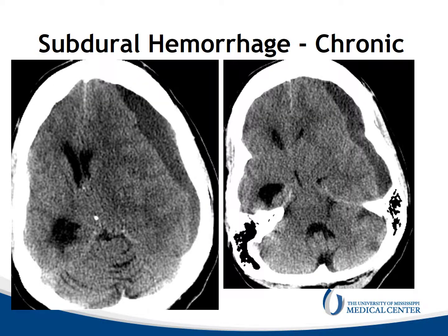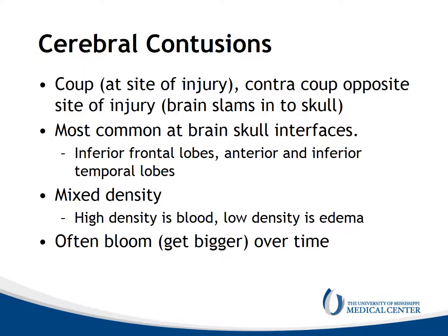Here's a chronic subdural hematoma. As we can see, it is hypodense, and it does cross the area of the coronal suture between the frontal and parietal bones. There is mass effect and midline shift, and we can see that the right temporal horn of the lateral ventricle is dilated, reflecting ventriculomegaly and a trapped ventricle.